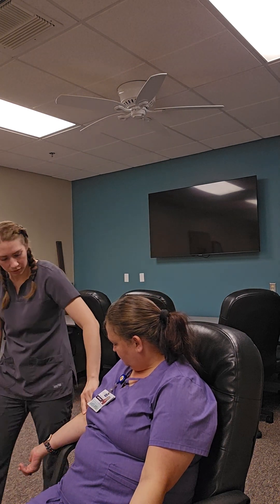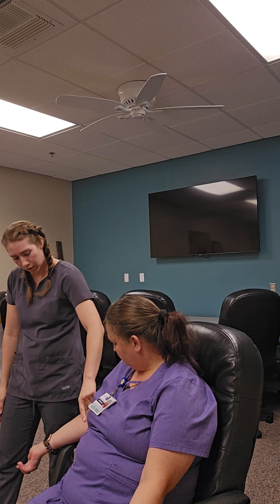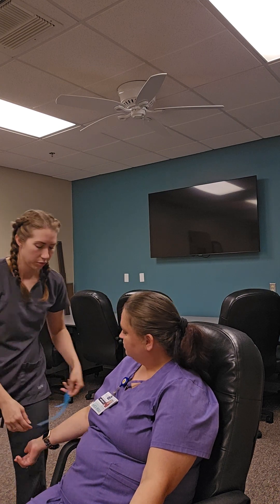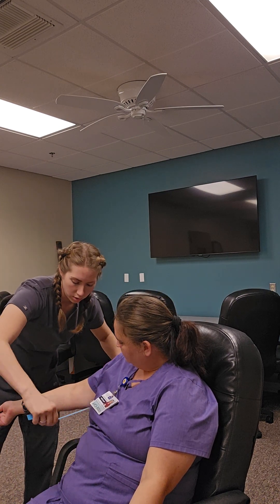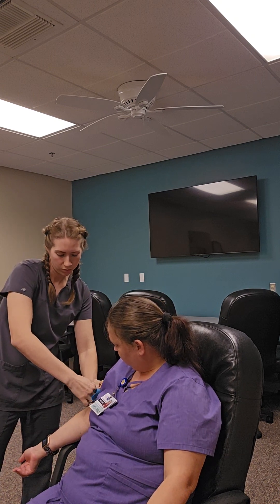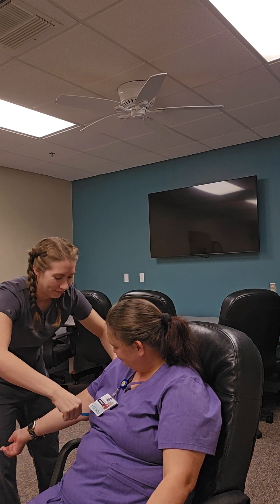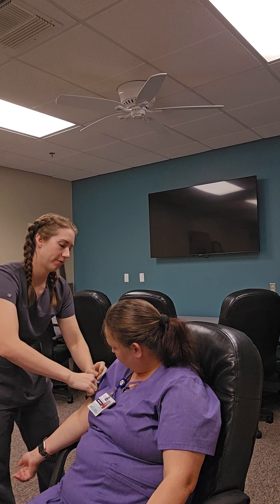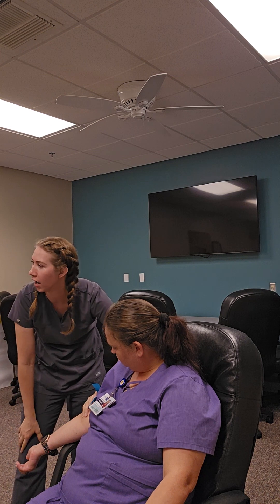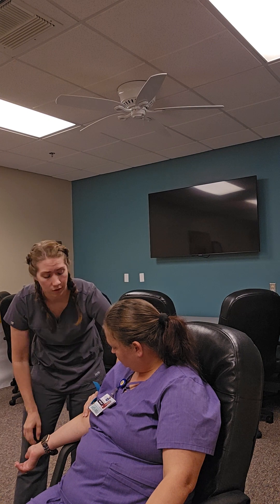Have your patient turn the wrist up so you can see the inside of the arm and look for some obvious things. There are three main veins we're looking for: the cephalic, which is right around here, your median cubital, and your basilic. So what I like to do first is put the tourniquet on. Go ahead and relax your arm — not too tight, but you want it about three fingers above the site you'll be drawing. Then go ahead and palpate for a vein, making sure it has a good amount of bounce back so you know it's not going to collapse on you when you go to draw from it.